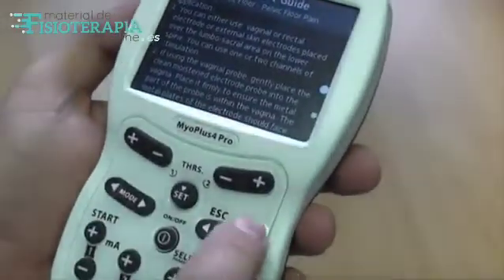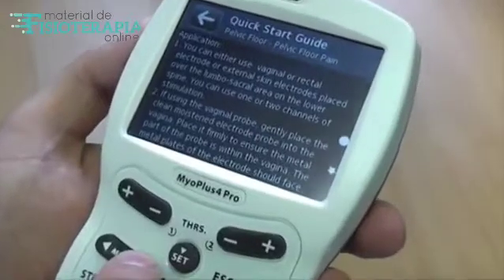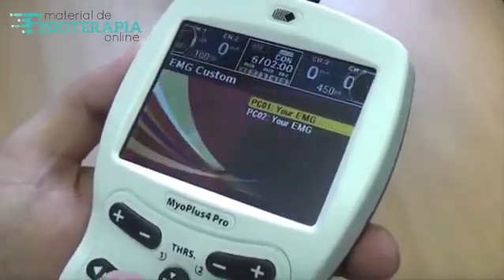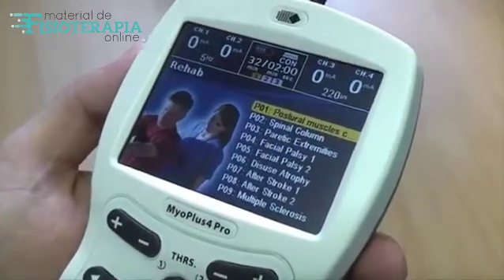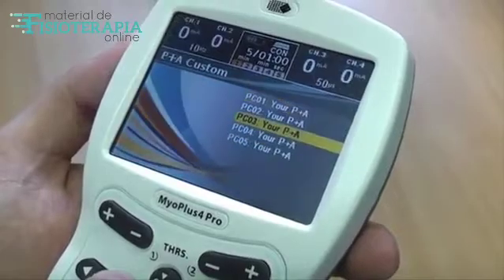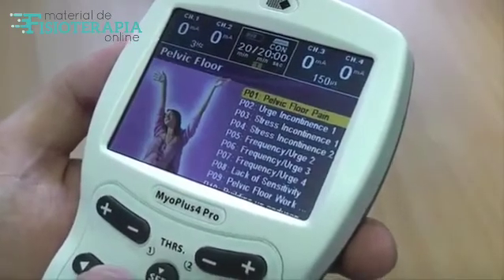The programs are categorised in groups called Clinical Modes. Press the Mode button to navigate among the Clinical Modes. The modes are Incontinence, Rehab, and some other custom modes where you can set up your own treatment. Keep pressing the Mode button until you reach the Incontinence mode.